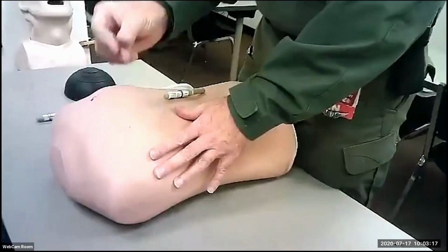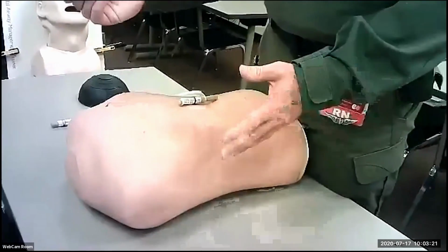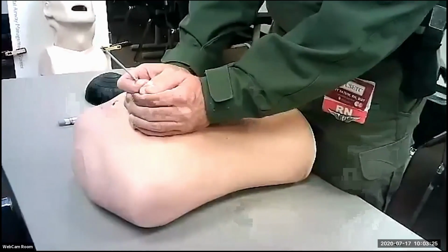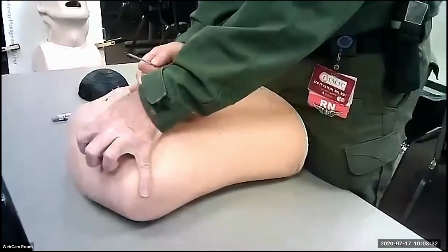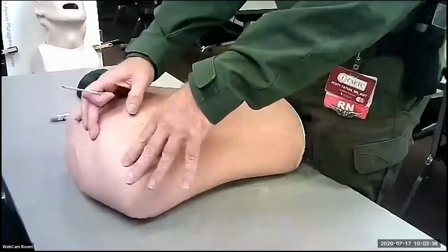The only way to relieve that extra pressure is to get it out. Just like a tire, if I poke this into the tire, it relieves the pressure. Same thing, I've got to relieve that pressure from around that lung and allow that lung to expand back out, okay? So I'm going to go second intercostal space, mid-clavicular.